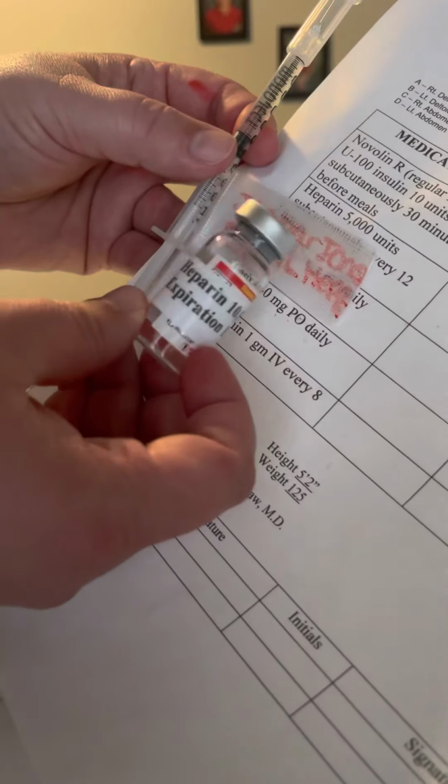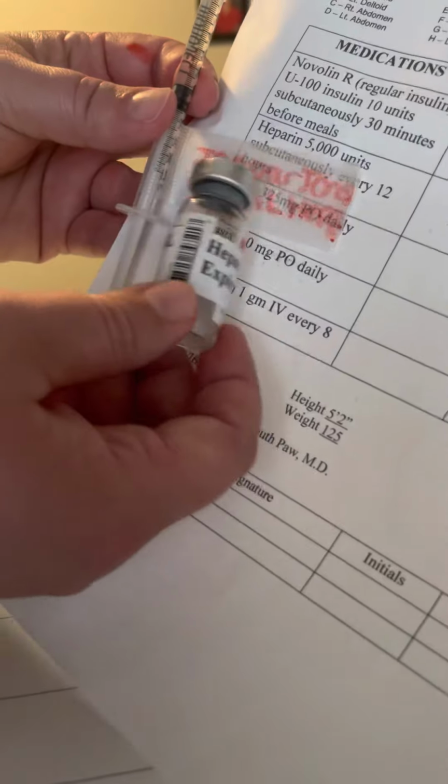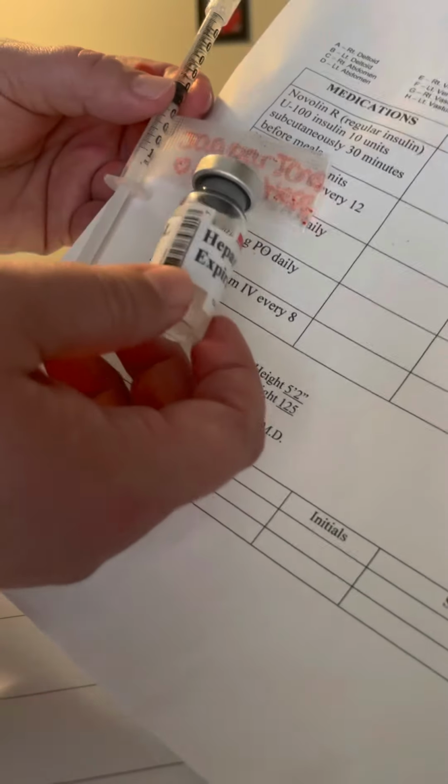So I have Jaguar J. Jones, and heparin, 5,000 units or 0.5 milliliters. And I have heparin, 0.5 milliliters, and my heparin vial. Heparin label 0.5 milliliters. Jaguar J. Jones. Now I'm going to go to the bedside.